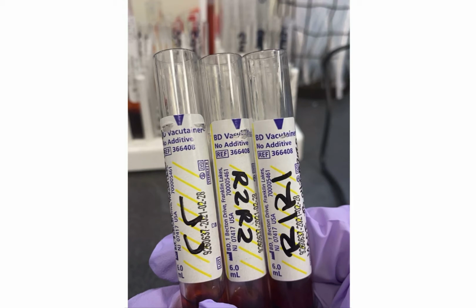The first step in the procedure, which I do not have a video of, is washing the reagent red cells 3 times and then a 4th time for at least 5 minutes, a hard spin. This is to remove any residual saline and to really pack the red cells down. We don't want to dilute the adsorbed plasma serum, as you'll see in this demonstration.